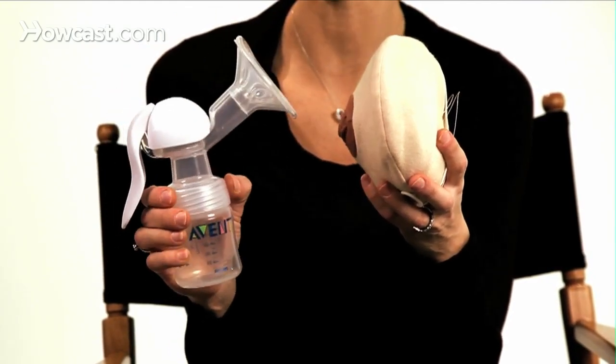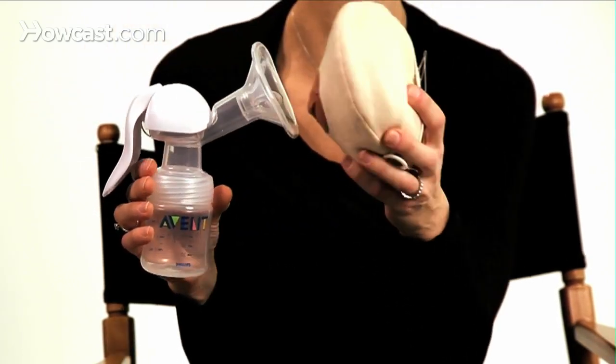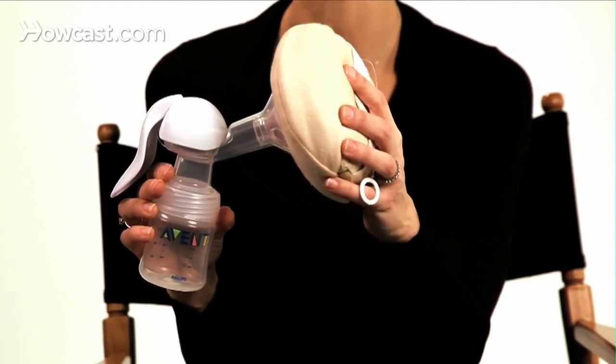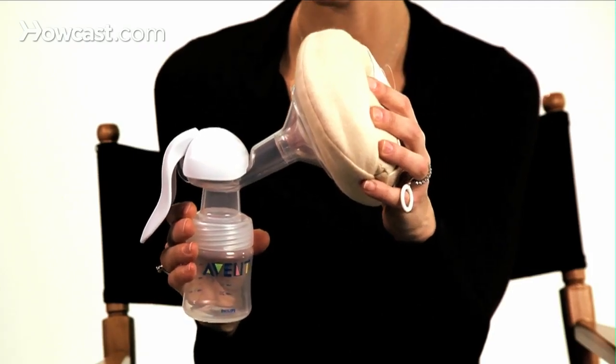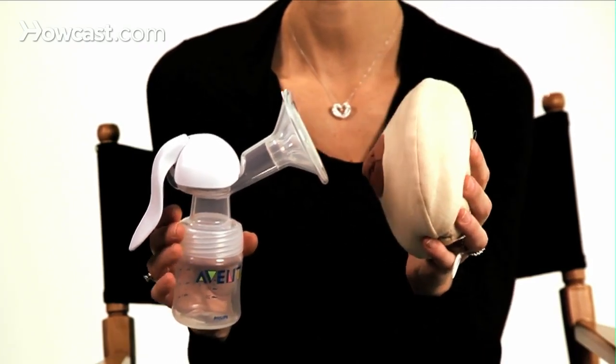It's really just screwing the top, what we call a flange here, and a pump. The pump is right there, and just making sure, no matter what, that your breast is centered perfectly in the middle before you start to use it. That's the key in most cases to the comfort of pumping, because if you're angled in a funny way, you can end up having the top of the nipple scraping or the bottom of the nipple scraping. You want to make sure the nipple's perfectly centered before you start to do it.